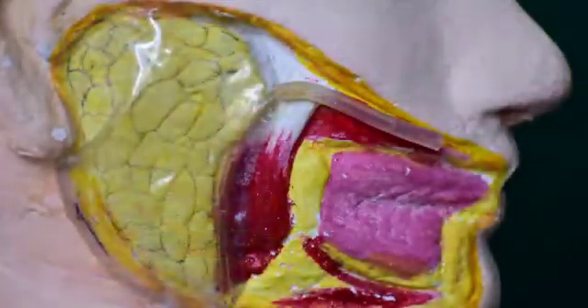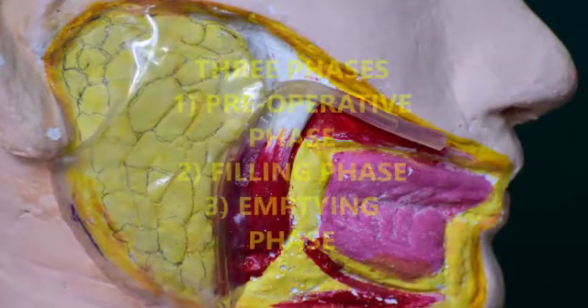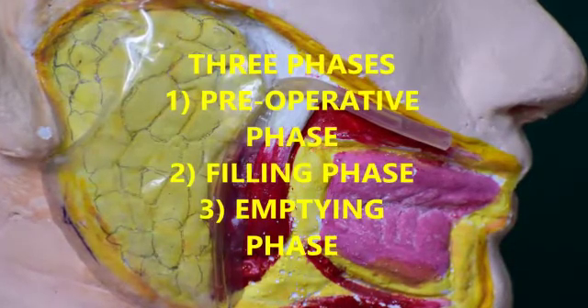The procedure contains three phases. The first phase is the pre-operative phase, where a preliminary plain film evaluation called scout film is done. Since it's a model, the radiographic evaluation cannot be presented.